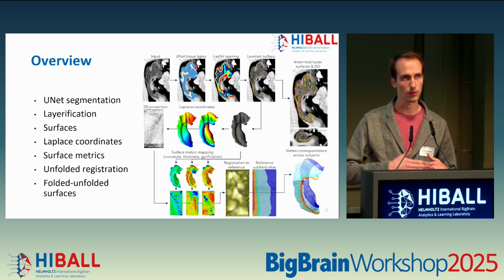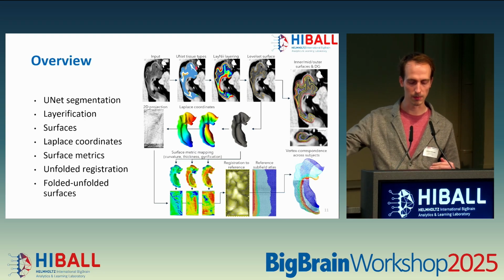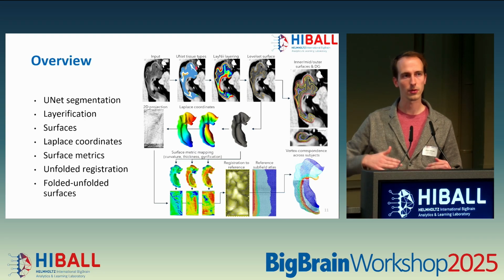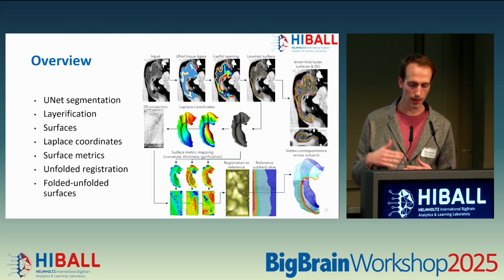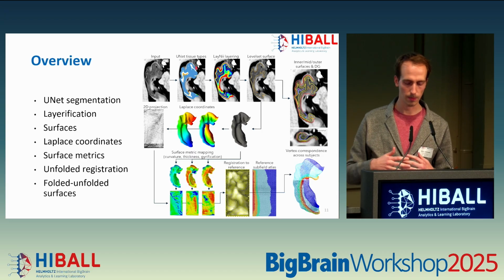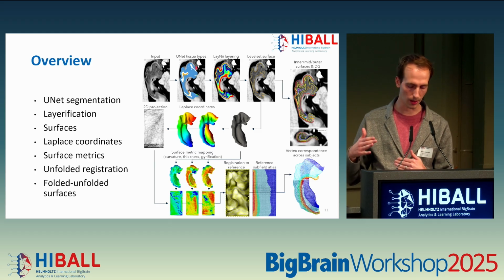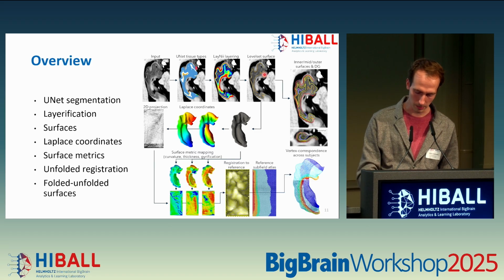This can be an equipotential or an equivolumetric model that spans from the inner to the outer surface. In the neocortex, you can think of it as white to pial surface. Then we'll draw a threshold somewhere along that, called the level set surface. We can draw a threshold at 0.5, which would be halfway between the inner and outer surface of the hippocampus. Maybe I'll just point to where, yeah, that works.